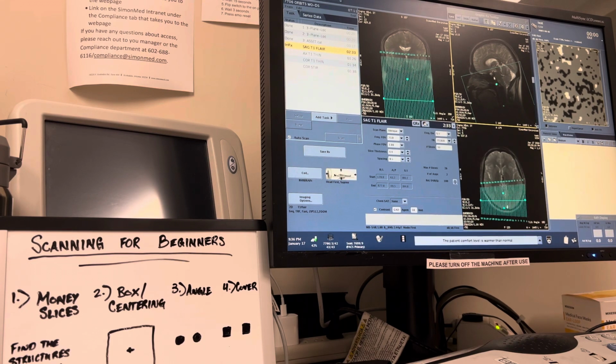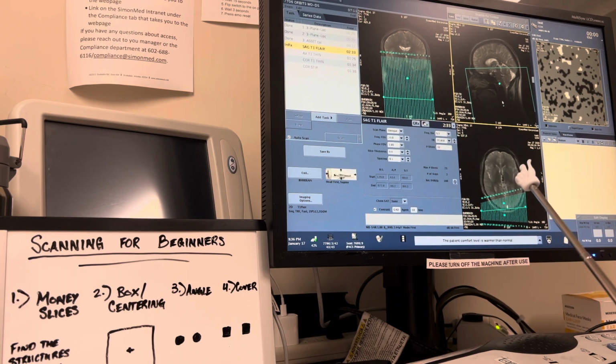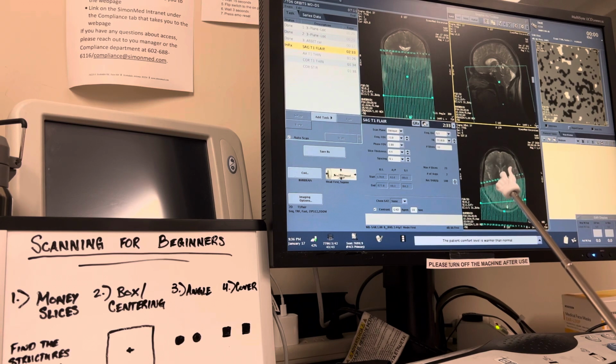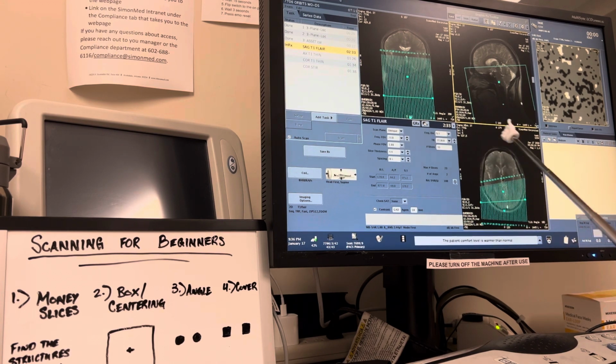There you go. Okay, it's a little much. Keep in mind the genu's right there, so let's go the other way. Keep going. Right about there. Okay, let's move it up and see if it's touching both. So we can probably angle it to the left ever so slightly. Perfect. Okay, now let's center that.